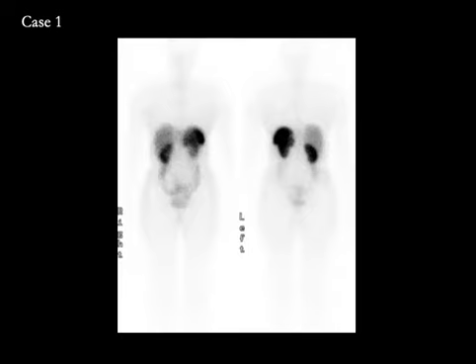Case number 1 shows whole body images in anterior and posterior projections in a patient with a negative octreotide scan. We see physiologic distribution in the spleen, which is best seen in the posterior projection. The uptake in the spleen is much more intense than the uptake in the liver, which is seen here, and there is excretion of the pharmaceutical from the kidneys into the urinary bladder. There is physiologic bowel activity. So those are the sites of physiologic uptake. There is no focal abnormal uptake to suggest presence of a somatostatin receptor expressing tumor.